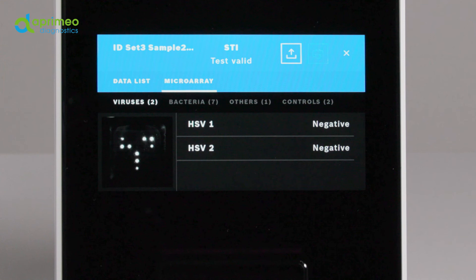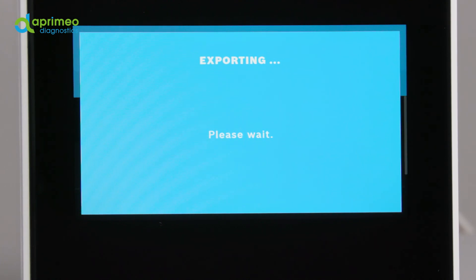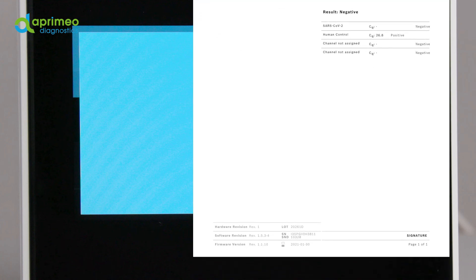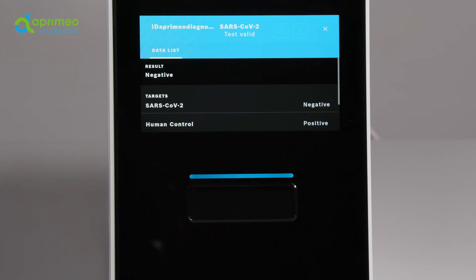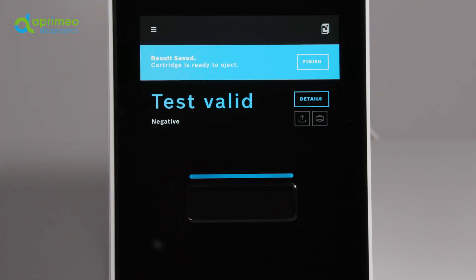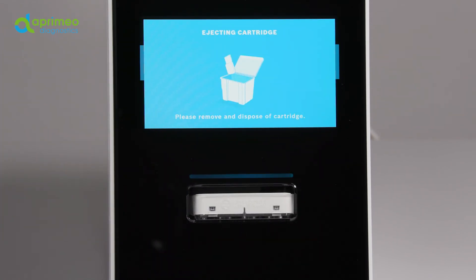You may export the data of the respective test in PDF format or print out a hard copy right away. The test result comprises sample and test information, the results and the raw data. Moreover, the document contains information about which user conducted the test, as well as general information about the cartridge and the device. After checking the test results, please go back to the overview screen. Select finish to eject the cartridge. The display will then switch to the welcome screen and you can take out the cartridge and dispose of it according to regional and lab-specific rules and regulations.